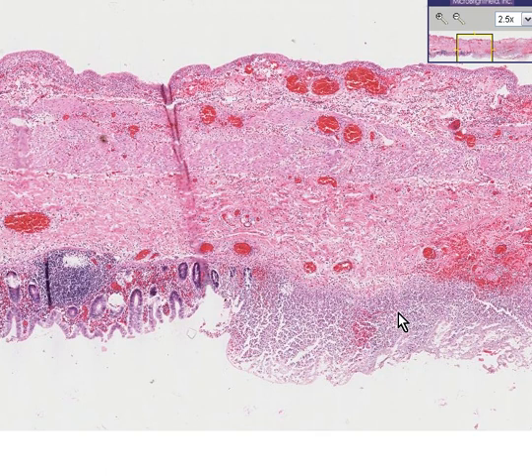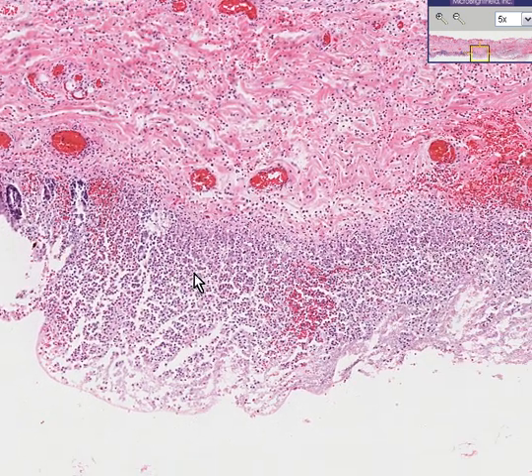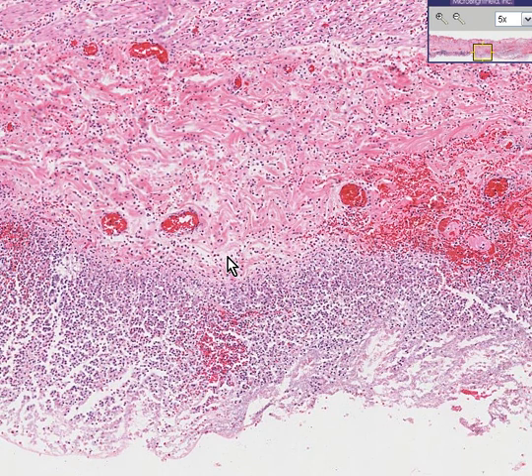appreciation for the appearance of the mucosa. It is no longer nicely arranged in terms of glands and lamina propria and muscularis mucosa. It seems to be basically fuzzy and gone. You don't see cellular detail very nicely. You don't see the muscularis mucosa very nicely.